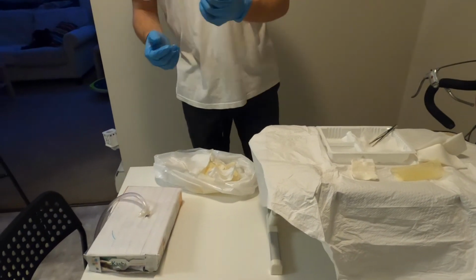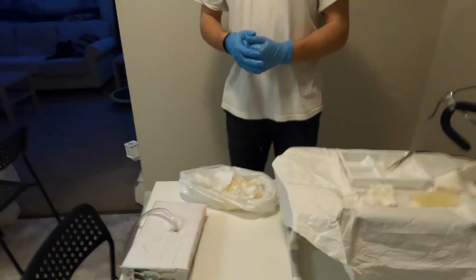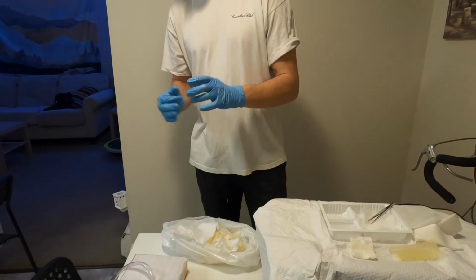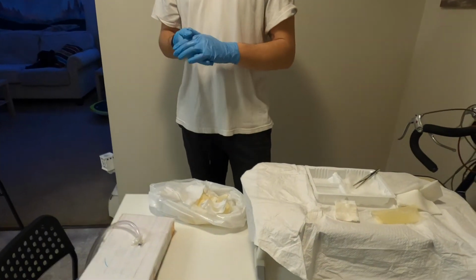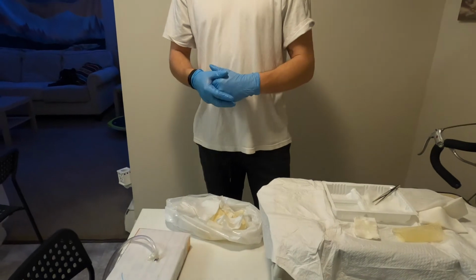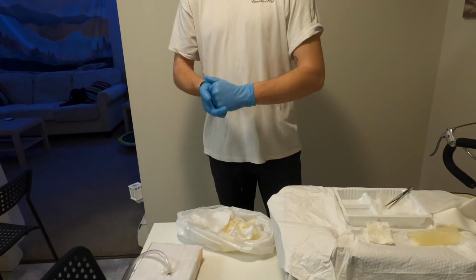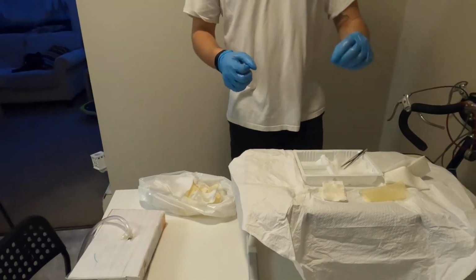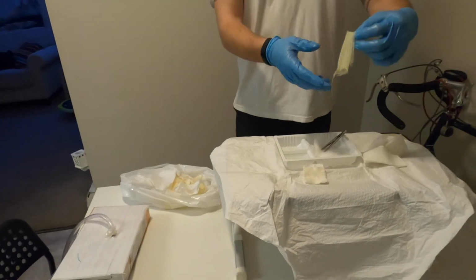Okay, so now I can assess the peri wound. So I'm looking for any signs of edema, inflammation, irritation. There's no drainage, like I said before. The chest tube is well approximated to where it was inserted originally. There's no foul odor. Everything checks out here. So yeah, now I can go ahead and put the new Gelinet piece on.